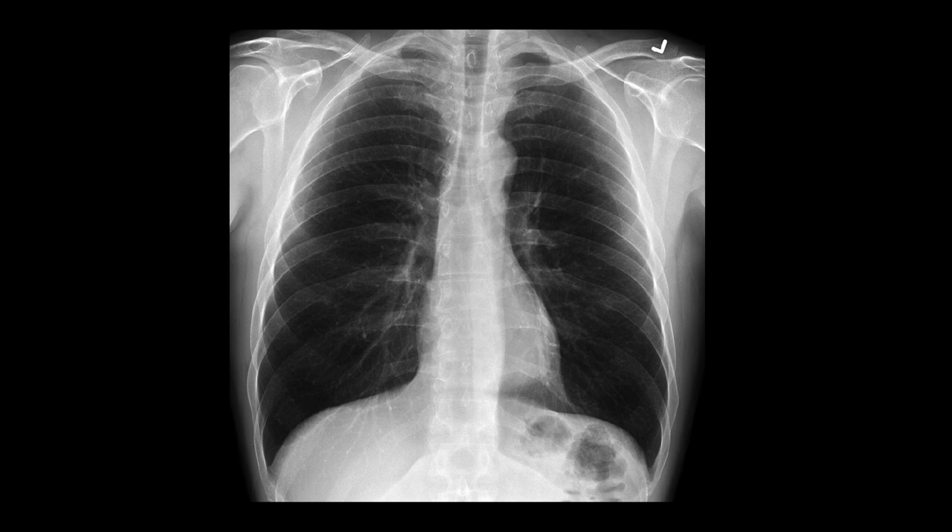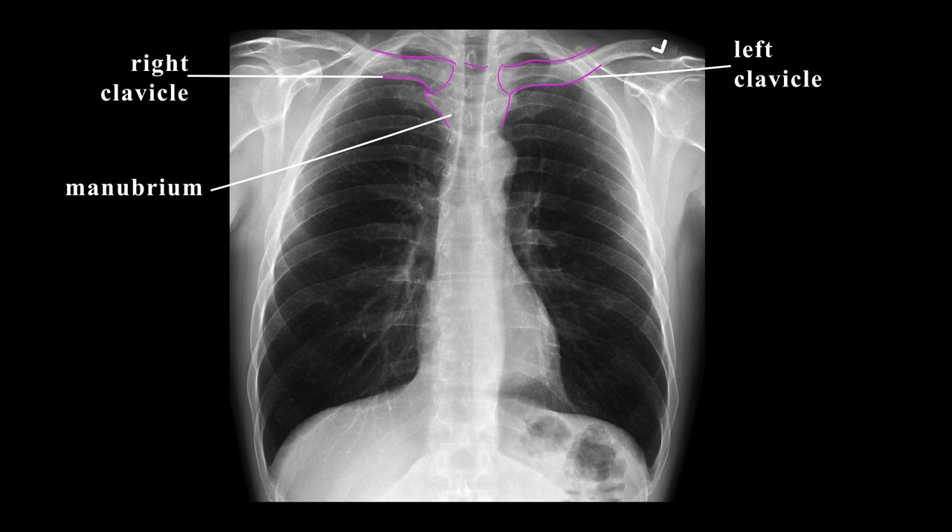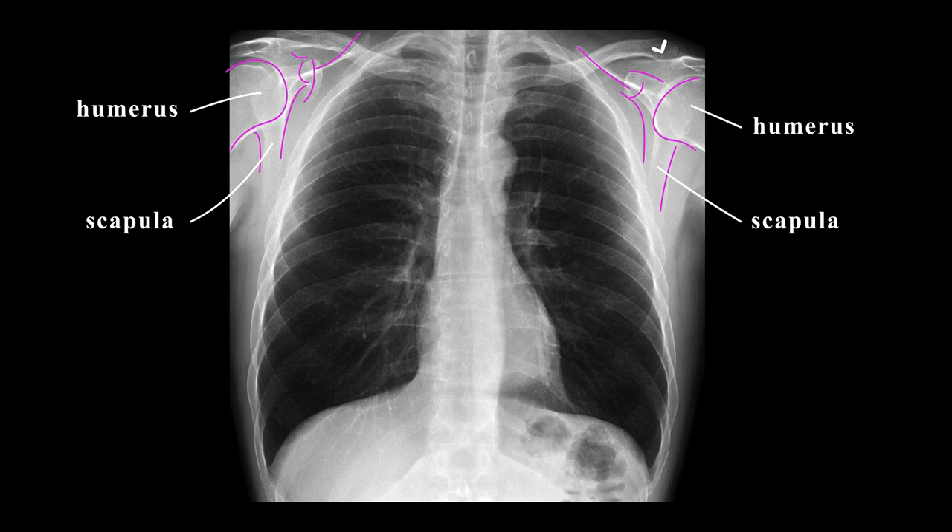Let's go over the bones next. I usually start with the clavicles to see if they're equidistant from each other, which is important in determining rotation of the x-ray. You may also notice the manubrium between each clavicle. Here are your scapula and humerus on the right and left side. Notice that you don't see the scapula overlapping your lung fields, because properly obtained plain films should have your scapula out of the lung field views so that your lungs are unobstructed by layers of bone and soft tissue.